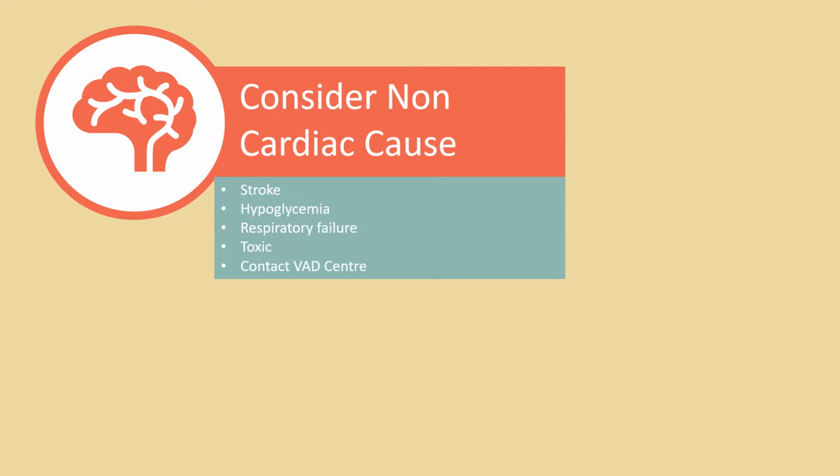You also want to pay attention to that issue we talked about of a thrombosed VAD that's not working. Here, if they're stable, you probably don't want to turn that VAD on until you've reached out to the VAD center. And I would do that immediately and work with them as the best solution to this problem that probably has no good solution.